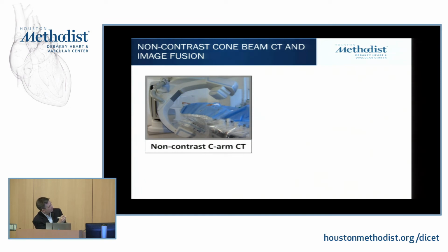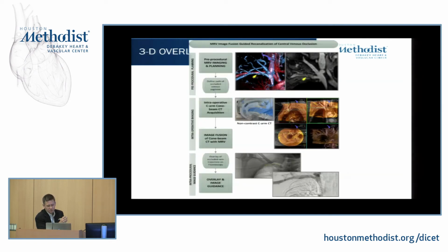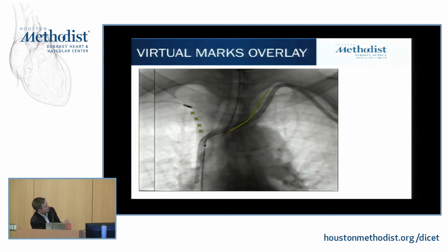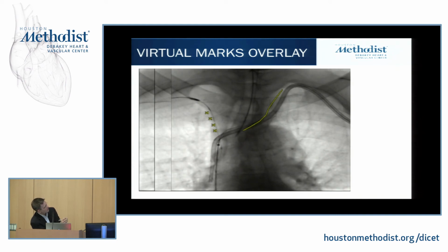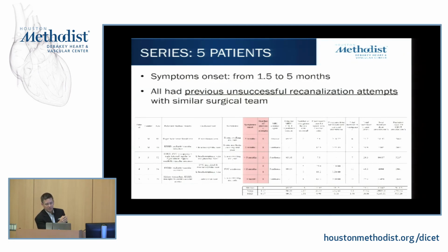We'll then go to the operating room to create an image using the bony landmarks and then provide that same overlay and fuse the images together. That can be hugely helpful to us in terms of cannulating difficult vessels, or in this case, recanalizing, and then basically go through and have successful reintervention. This is a case then where Jean's done that exactly, gone through and projected where that track should be based on the position of the catheter and other landmarks, and then successful recanalization, angioplasty, and then restoration.